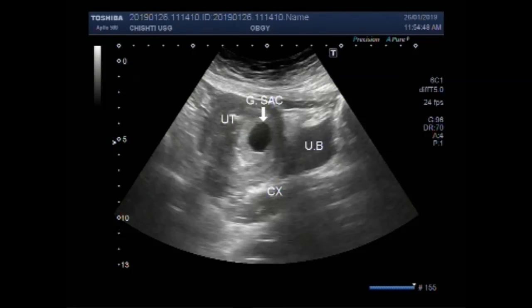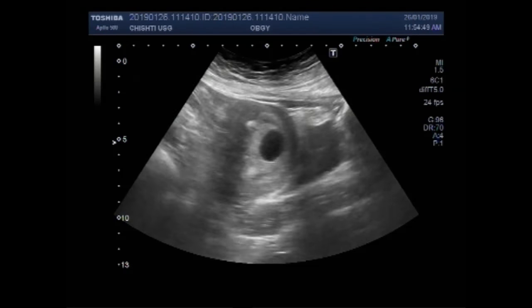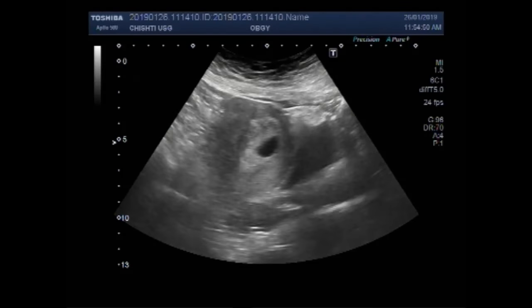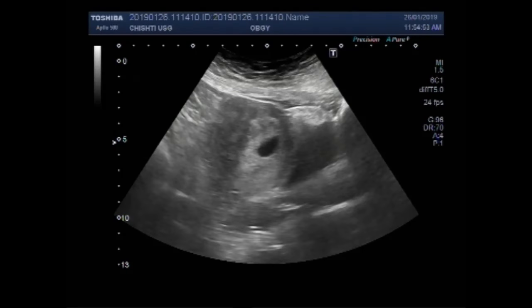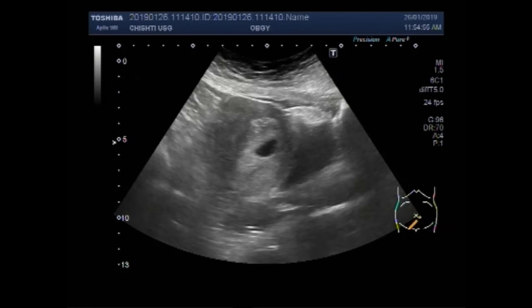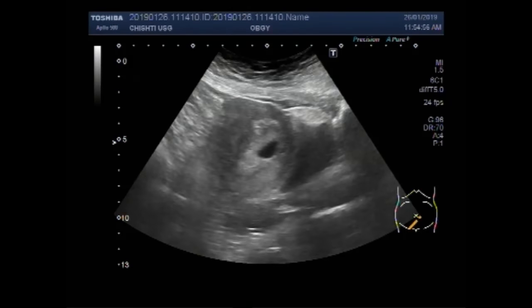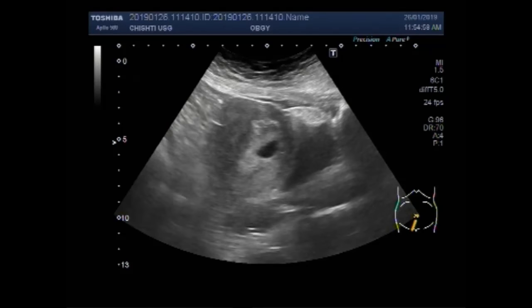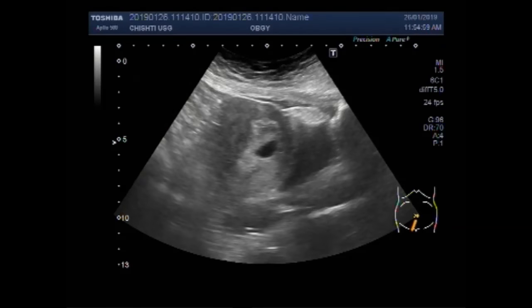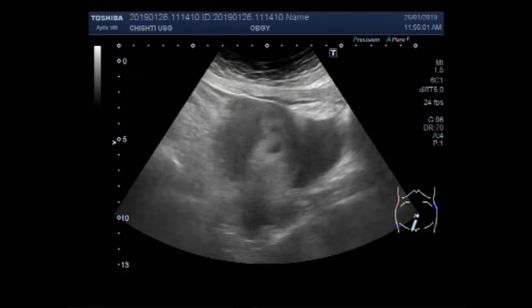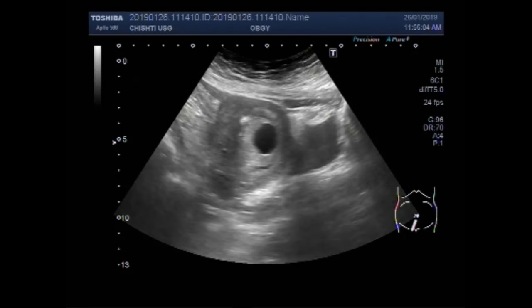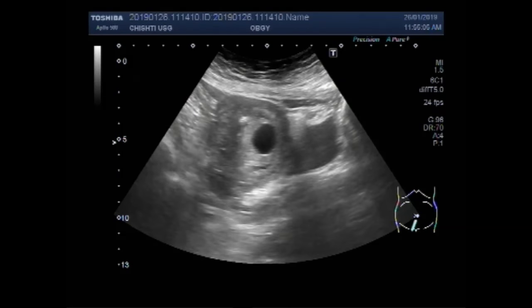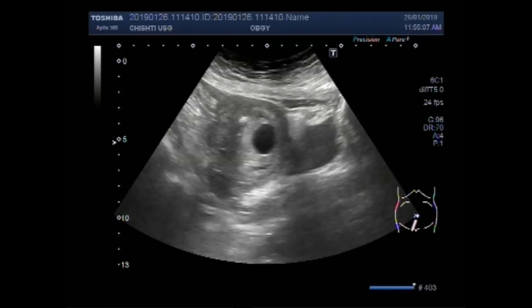An embryo is usually seen within the gestational sac by 6 weeks of gestation. One of the more common types of miscarriages, known as anembryonic pregnancy, empty sac, or blighted ovum, happens when a gestational sac does not contain the embryo.